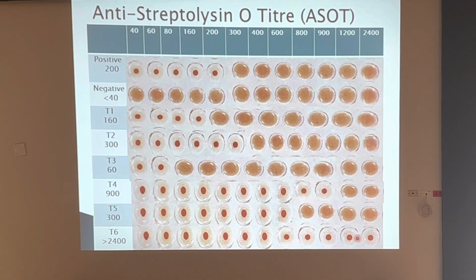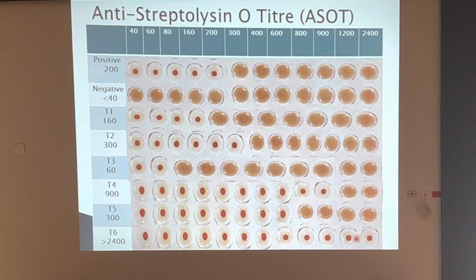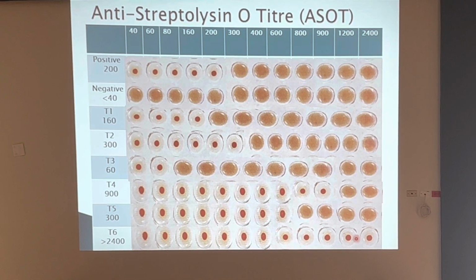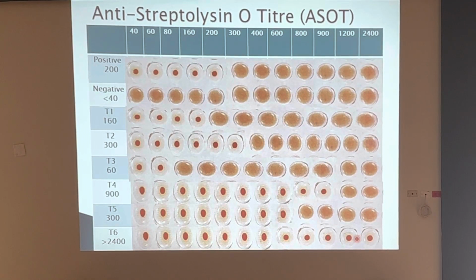Well, she's asking what would you do if you ended up with a doubtful. If you end up with a doubtful, based on the patient's other signs and symptoms, did you isolate a group A strep from their sample? Was there a fever? Was it a skin infection? Was it scarlet fever? Based on all of that, which is why there's no one lab test that we use to diagnose.